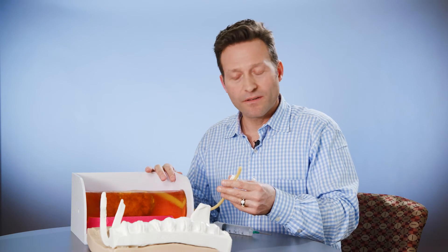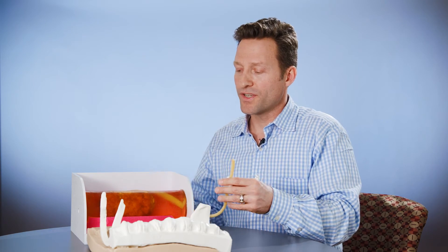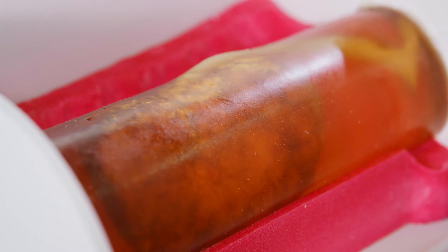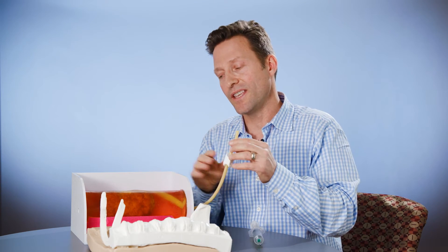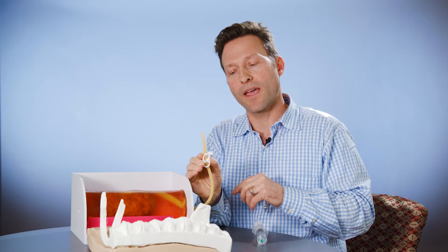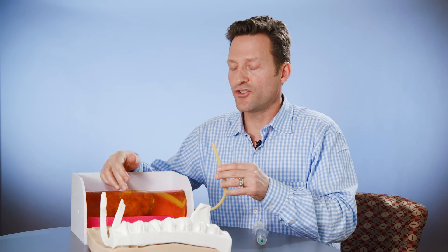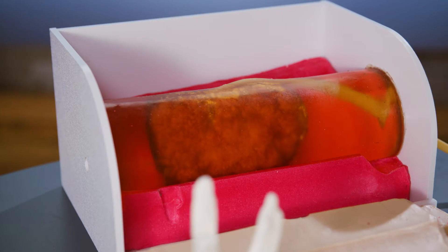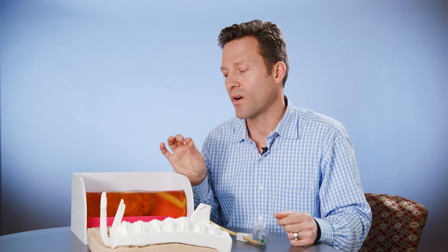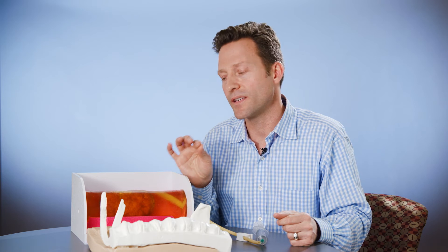To operate or use this kidney trainer under ultrasound, you would inject or fill the hollow kidney with a solution. Once the kidney is filled, you can clamp it off via the provided clamp and inject even more water to create a hydronephrotic condition. You'll literally get needle drip, which is a key sign that your access to the kidney is spot-on.